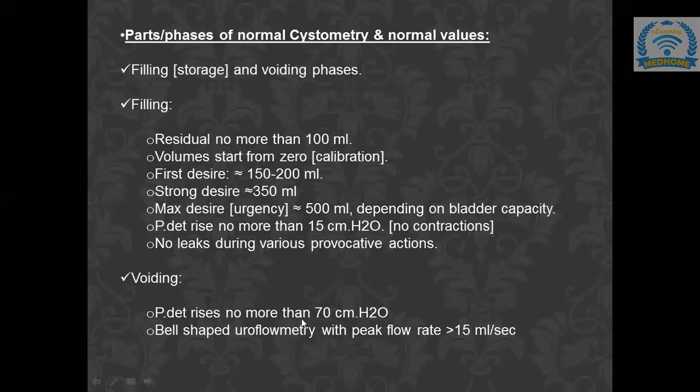And normally the shape is a bell shape. Otherwise, we don't need to remember the shapes because they are different shapes and they have no importance in diagnosing the condition, whether it is urodynamic stress incontinence or detrusor overactivity. Okay. So please go next.